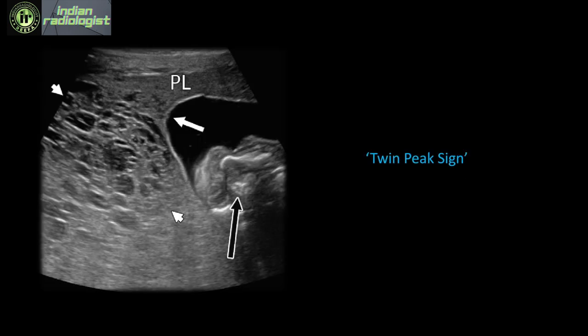The best way of imaging these patients is by demonstrating the twin peak sign, which shows two discrete pregnancies with two discrete amniotic sacs and two discrete chorions — one containing a normal pregnancy with a normal placenta and the other having a molar gestation. These patients need to be closely followed up.